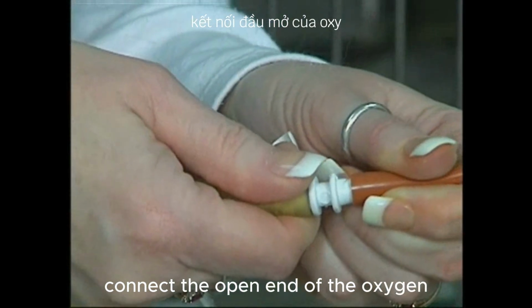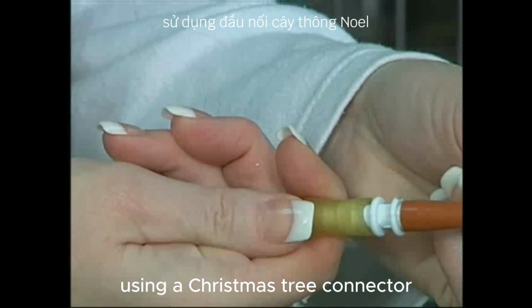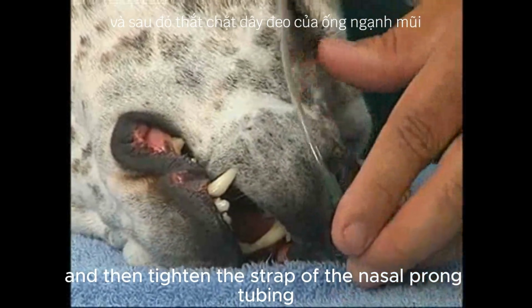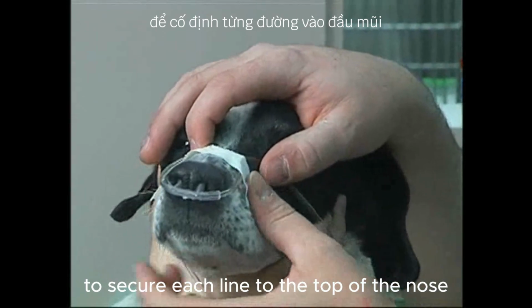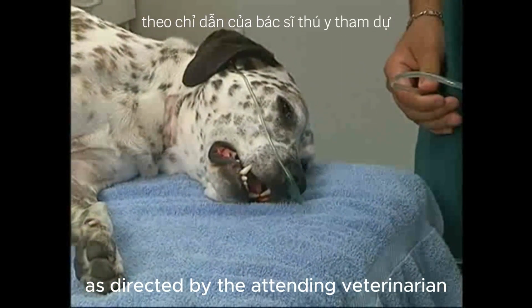Connect the open end of the oxygen tubing to the nasal prong tubing using a Christmas tree connector, as seen here. Carefully place the nasal prongs into each nostril and then tighten the strap of the nasal prong tubing behind the ears to secure the unit to the patient's head. Use the 1-inch medical tape to secure each line to the top of the nose. Administer the supplemental oxygen as directed by the attending veterinarian.